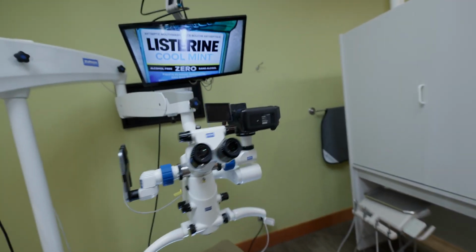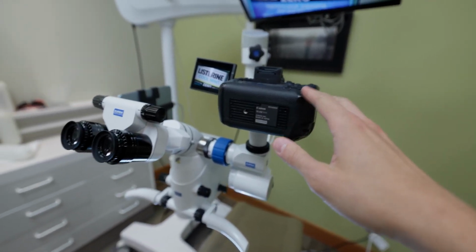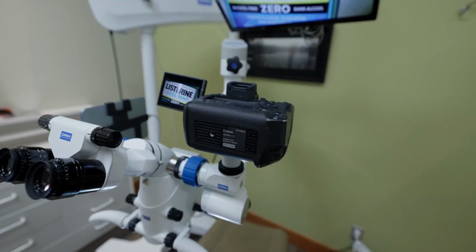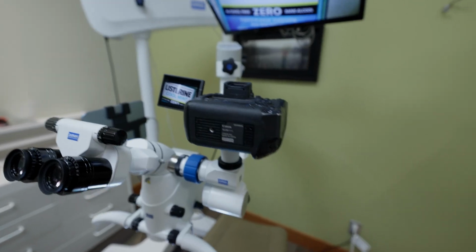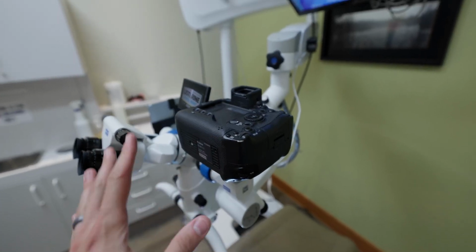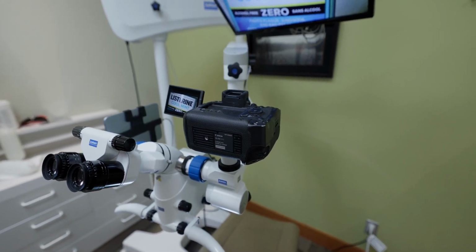Now, on the other side, we've got a mirrorless camera. So this is the Canon R3. This is about as heavy as a camera you'd want to put on here. It supports it just fine, balances just fine, but I wouldn't say much heavier would be wise. To be fair, I haven't used this thing once. The camera is not necessary, and I'm going to tell you why in a second, but I used to use this exclusively on all of my microscopes or a similar mirrorless camera because that was the only way to get good quality images and video out of a microscope.